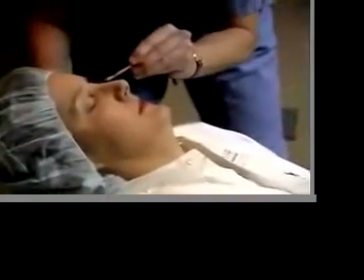When you get to the laser center and come in, the first thing we do is usually give you a little relaxing medicine like Valium. It's just to take the edge off. So then we bring you into the pre-op area, and in there they clean around your eyes just to make sure there's no bacteria.